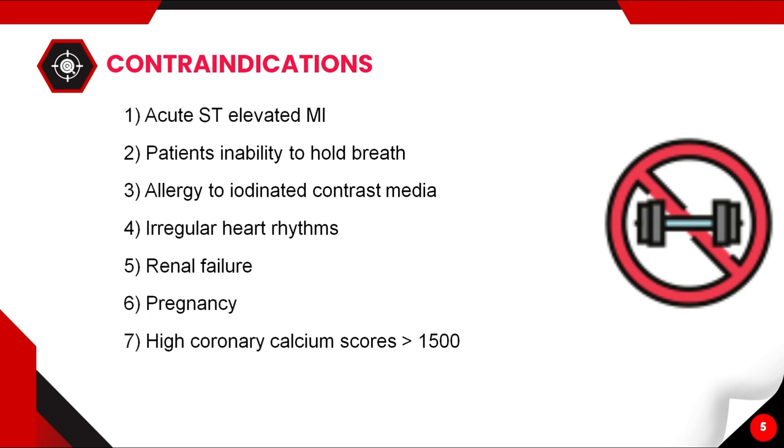and in patients with irregular heart rhythms like atrial fibrillation and heart blocks, in renal failure and pregnancy, and patients with high coronary calcium scores such as more than 1500. In such patients, the dense plaques limit the evaluation of the stenosis. So we advise invasive coronary angiography in such patients.